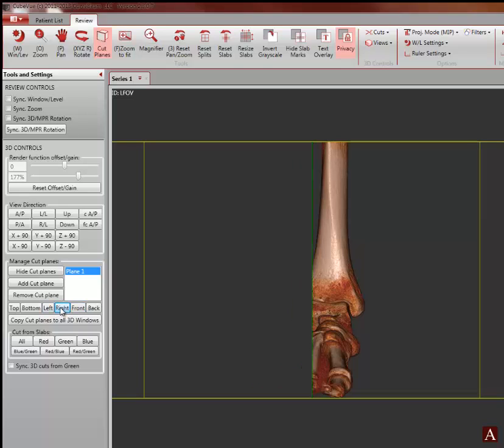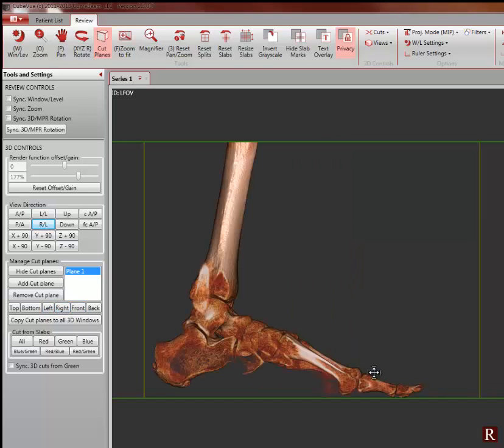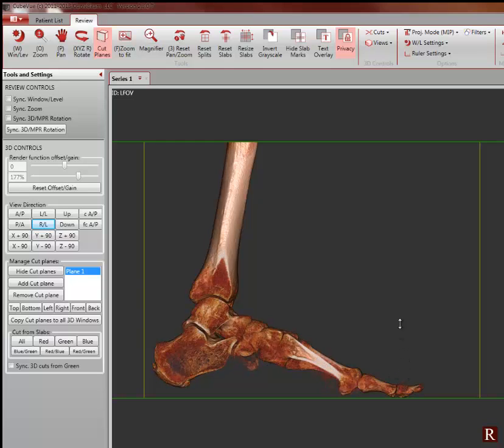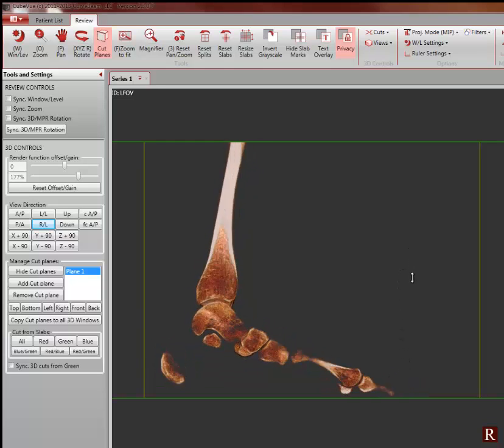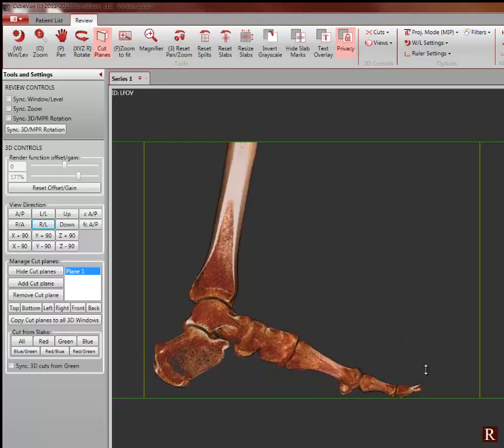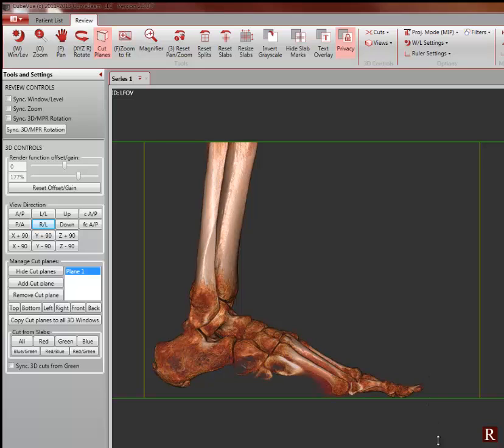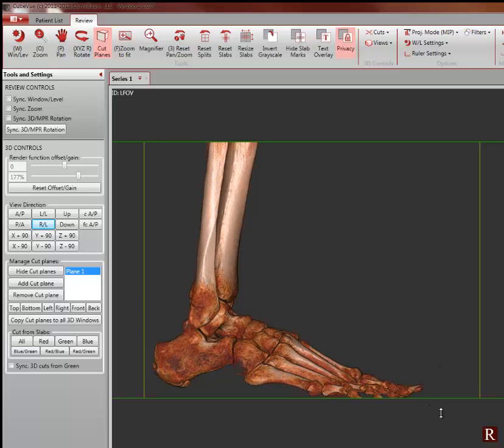In this next example, we have inserted the cut plane from the right side and will now peel and add anatomy. Again, we are holding down the shift key and dragging the mouse up and down.